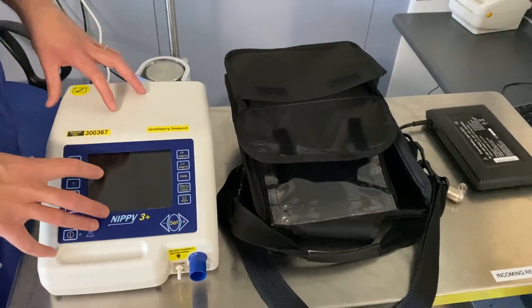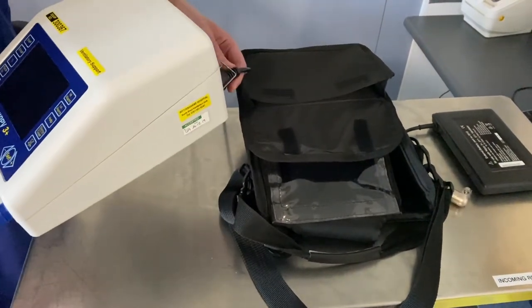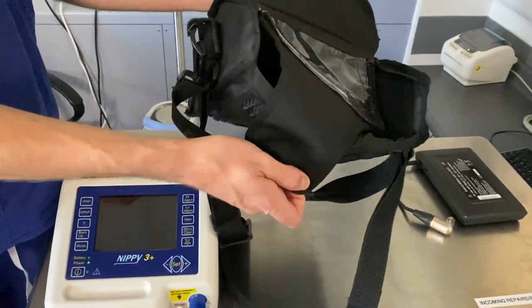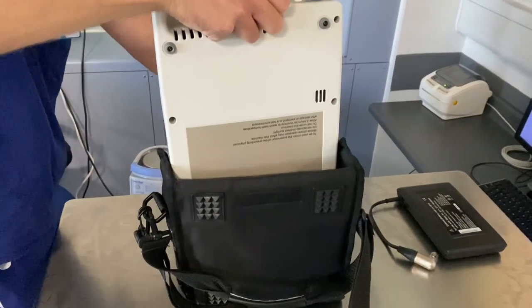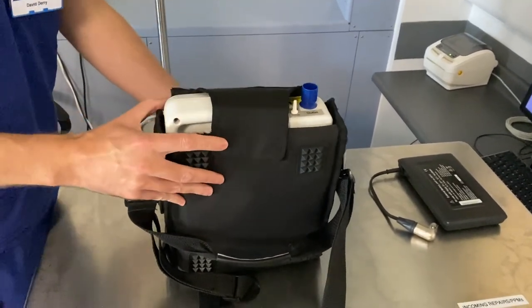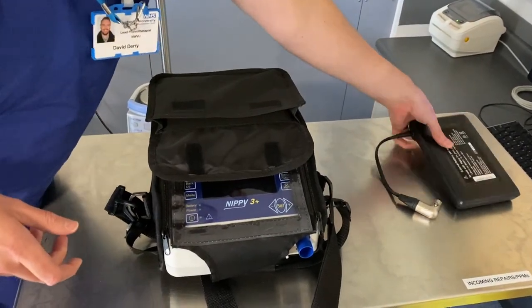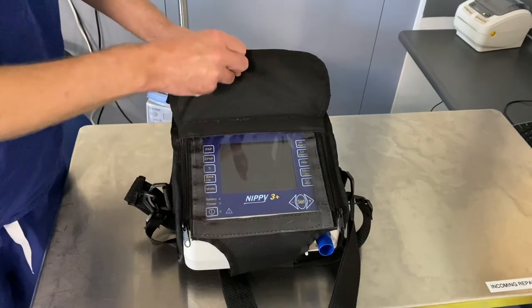I'm going to show you now how to put your NIPPy 3 Plus ventilator into the carry case. Disconnect the power cable from the ventilator, take the carry case and open the front section. Lift the ventilator up and slide it into the carry case — the flap should be folded over and zip sealed. In the top pocket you can place your external battery, feed it through, push it into place, and close the flap over the top.